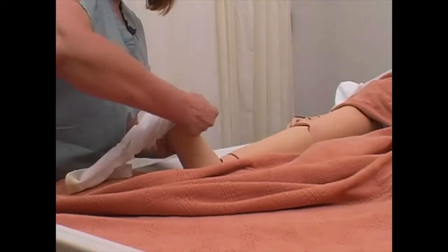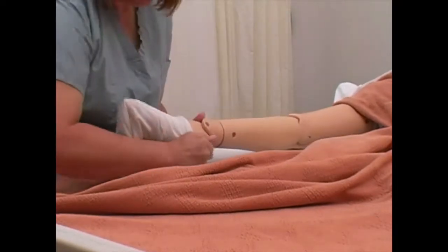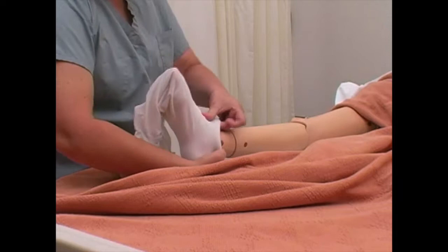Slide the stocking over the toes, foot, and heel. Ensure the stocking is seam side out and the heel is positioned correctly.